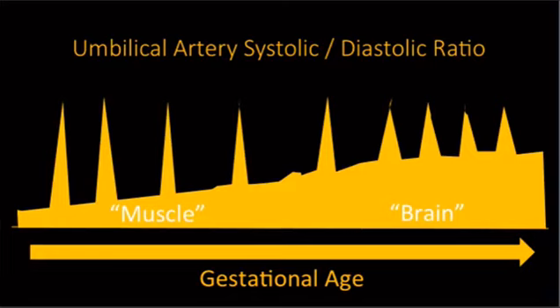So remember that external carotid has a high resistance pattern because you want to be able to turn that thing on and off, whereas the brain requires continuous diastolic flow, so it has a low resistance pattern. So remember the difference between here and here: a large difference is a lot of resistance. Small difference.